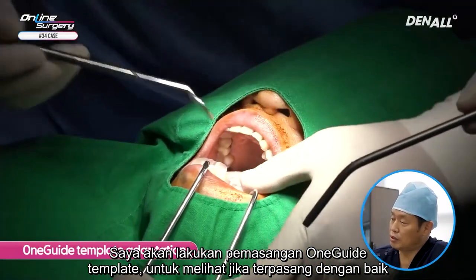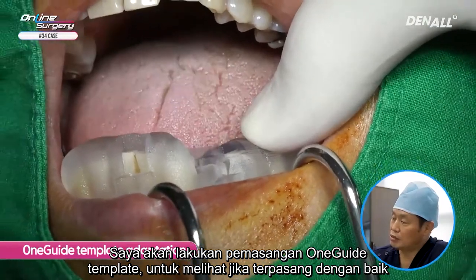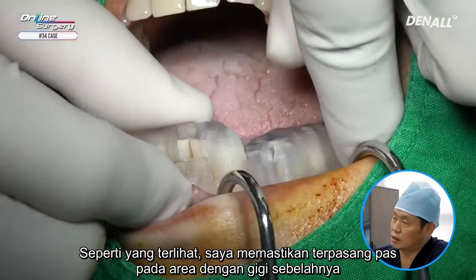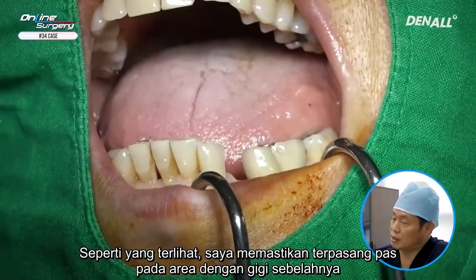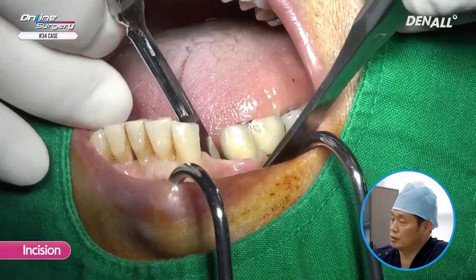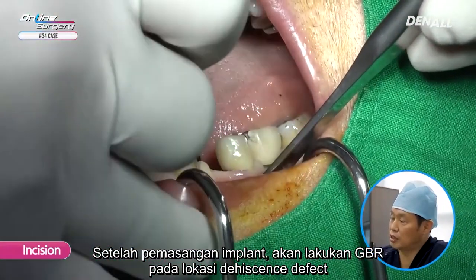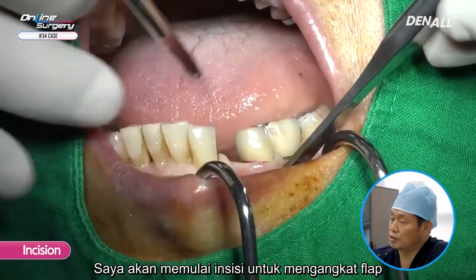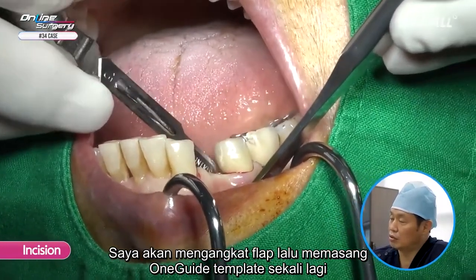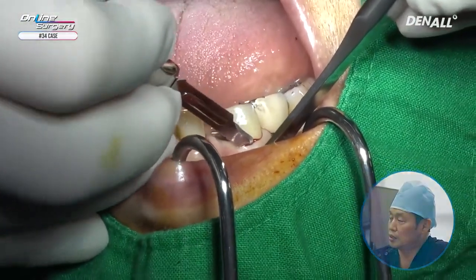I'm going to adapt one guide template to see if it fits well. As shown, I check once again whether it fits well in the area with the adjacent teeth. After implant placement, GBR is going to be done on the dehiscence defect, and I'm going to make an incision to reflect the flap first. I'm going to reflect the flap and then adapt one guide template once again.